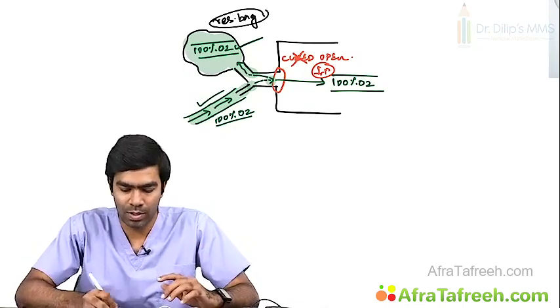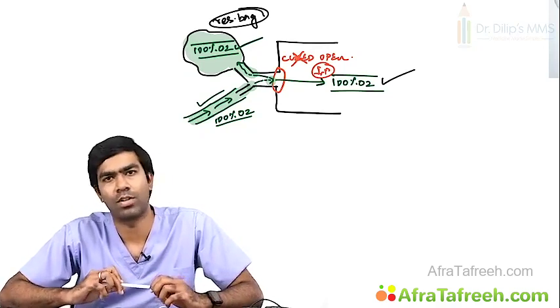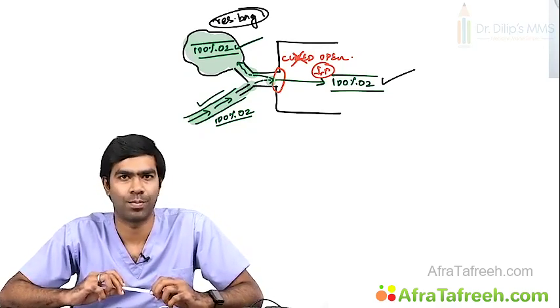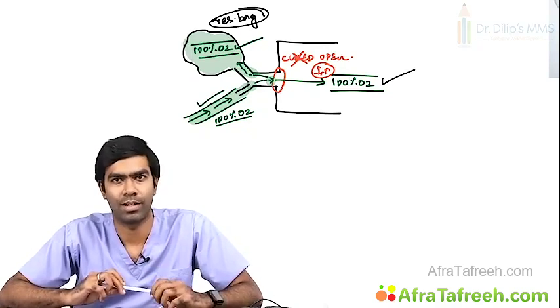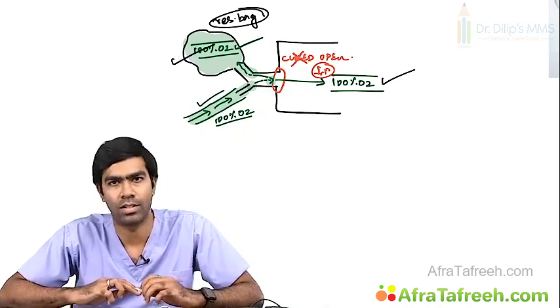That's the idea of a reservoir. So with the reservoir, you can theoretically and practically achieve 100% oxygen or 100% FiO2. Very, very important point. Clear? Without a reservoir, you will not be able to do that. So that's why it's always better to use a reservoir.